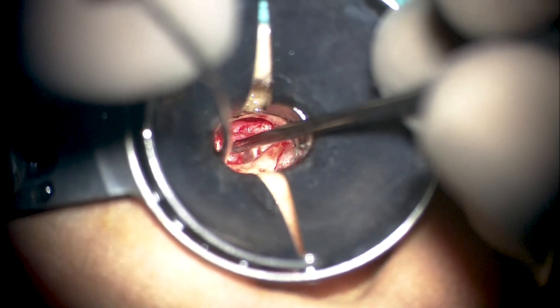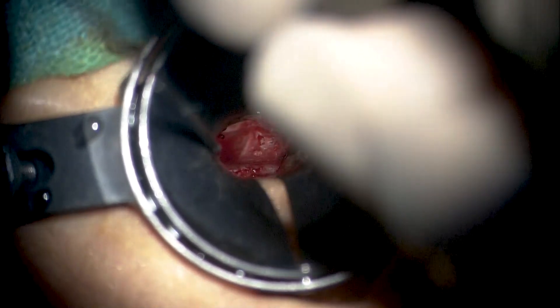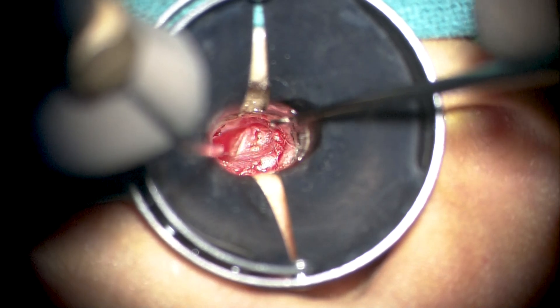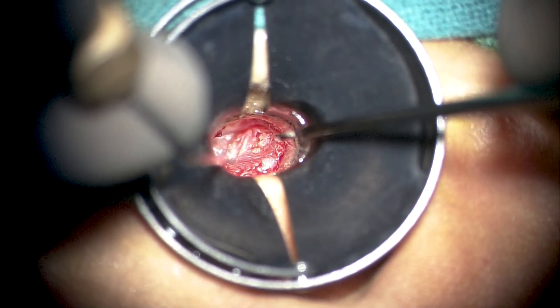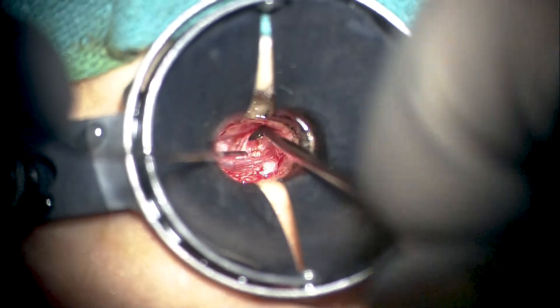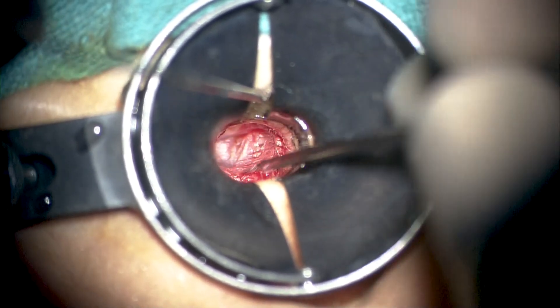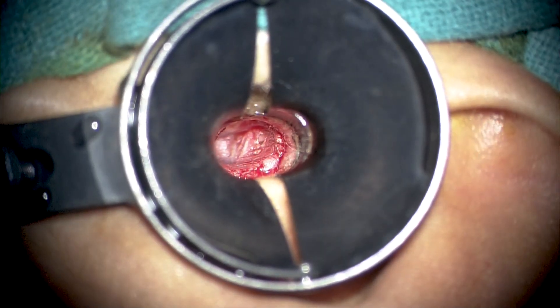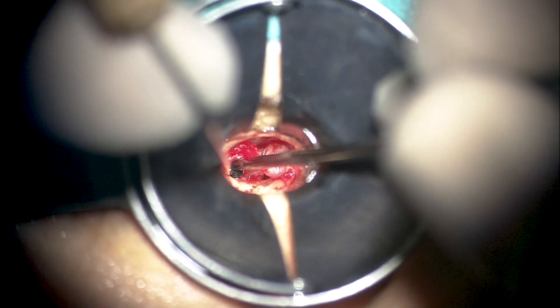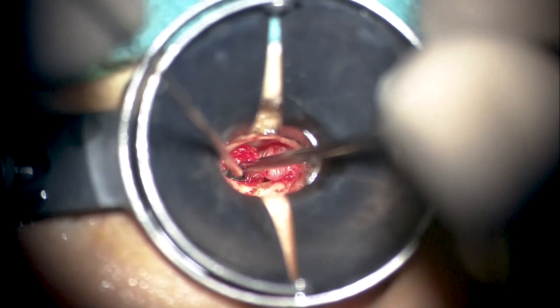Now we need to elevate the rest of the pocket from the chorda tympani as well, which may not be easy. Normally one could sacrifice the chorda tympani and excise the pocket completely. However, given that it has already been done on the opposite side with a modified radical mastoidectomy, and given that this is a pediatric patient, we are making all efforts to preserve the anatomic integrity of the chorda tympani — not to let it desiccate, not to place too much stretch on it, and not to cut it, to avoid permanent taste disturbances.